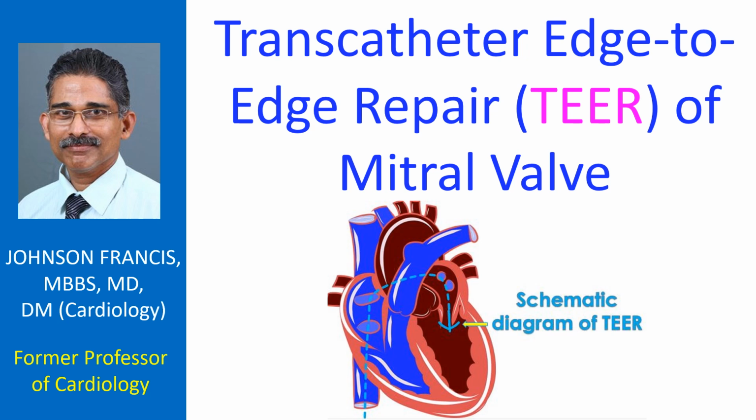Transcatheter edge-to-edge repair of the mitral valve is done for treatment of mitral regurgitation. Anterior and posterior leaflets of the mitral valve are approximated using a clipping device and is similar to the corresponding surgical procedure known as Alfieri stitch.